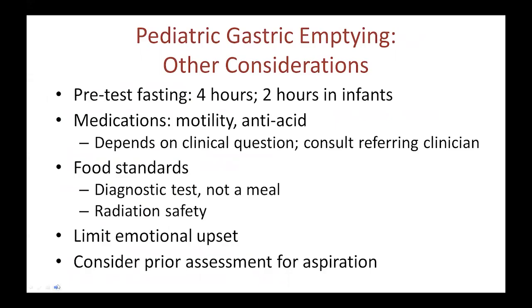Other considerations, patients should be fasted before this study. We typically tell families to fast the patients for 4 hours. Although, if you have a patient who has markedly delayed gastric emptying and the clinical suspicion is quite high, it may be appropriate to have them fast for a longer period of time, as we know there's going to be a prolonged delay in clearance of the prior meal from the stomach. Infants typically cannot fast for this long, and we ask them to fast only for 2 hours. This usually is appropriate because, in fact, they're taking only liquid meal, and that is going to clear faster.